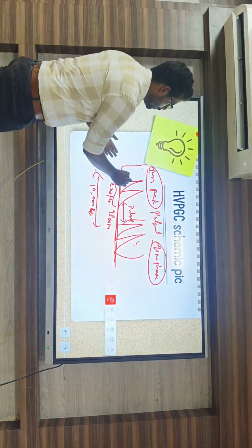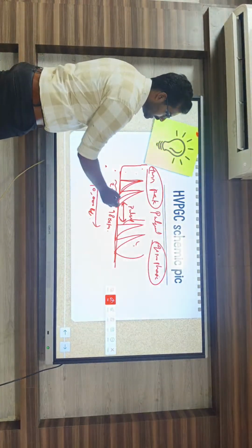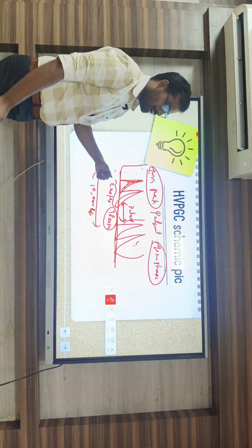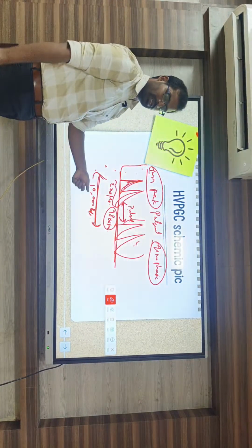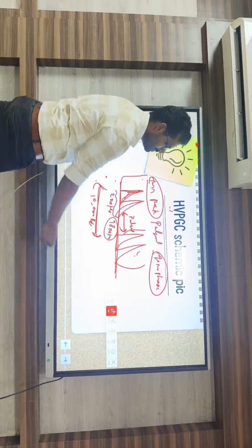This is the twin peak pulsed monophasic current. The off time is 9800 µs and the on time is 200 µs. So a single pulse takes 10,000 µs. This is the consequence of high voltage pulsed galvanic current.